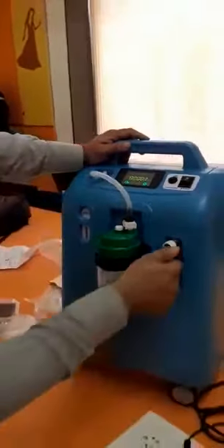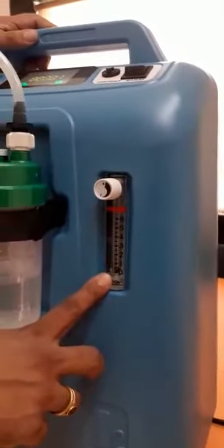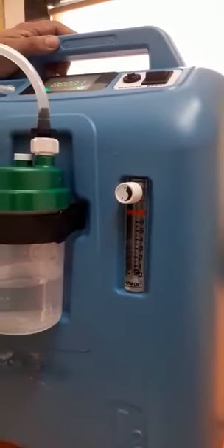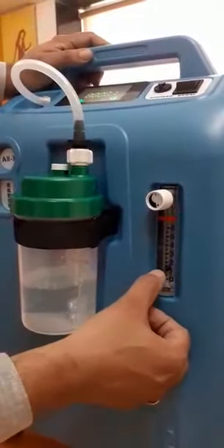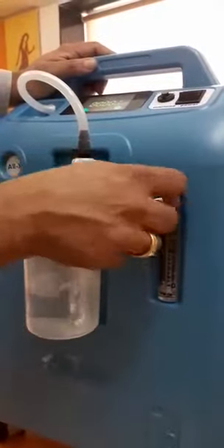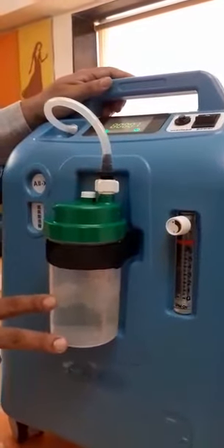Now, how to adjust the flow — I am turning this to zero, which means there is no oxygen flowing. You can see there is no air coming out. When I increase it, there is air coming out, and you can see it is between 1 to 2 litres. You can increase this up to 6 litres. The aim is to make sure that if you are taking an oxygen saturation reading, the level should be between 95 to 96.